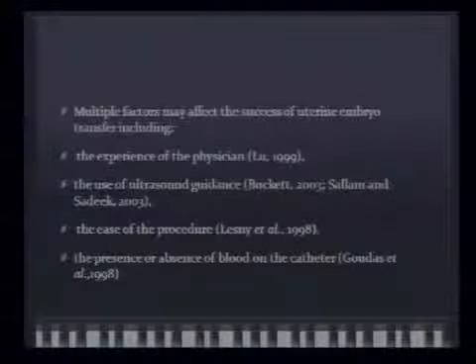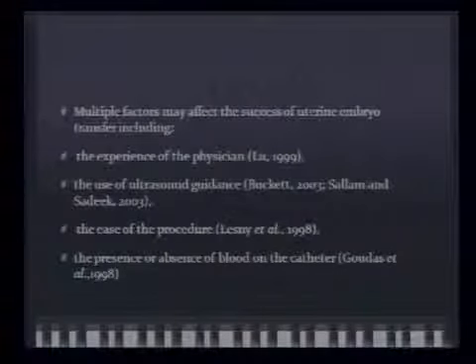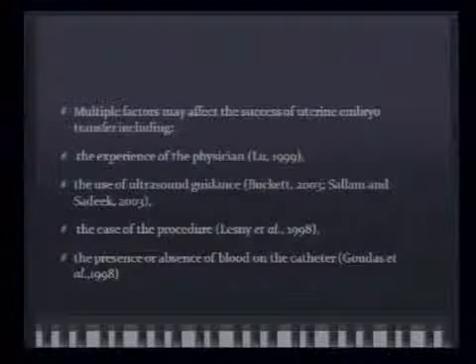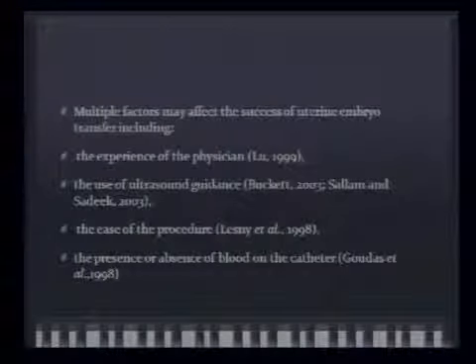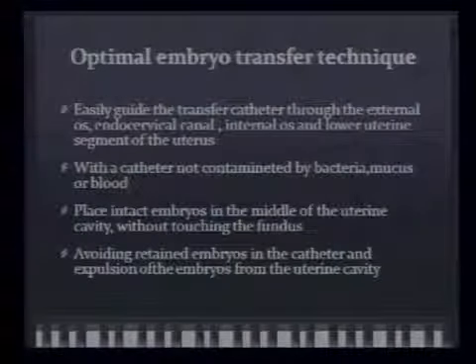Multiple factors may affect the success of the uterine embryo transfer, including the experience of the physician, which is very important, the use of ultrasound guidance, the ease of the procedure, and the presence or absence of blood in the catheters used. What is the optimal embryo transfer technique?